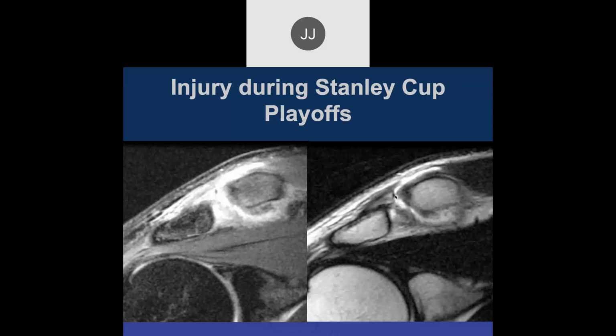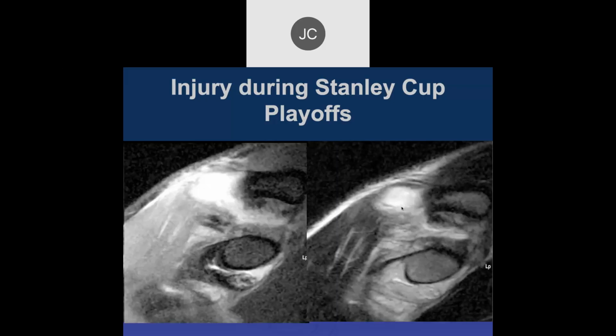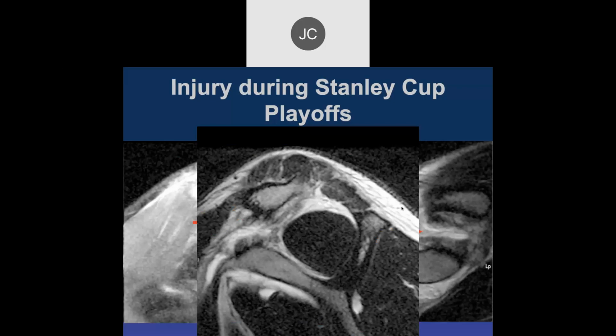So some edema of the acromioclavicular joint and then disruption of the ligament. Okay, so now what do you want to look at next? I would like to look at the coracoclavicular ligament, which, this is the coronal plane. Oh yeah, there's a transversely oriented tear through it, so separated. This would be another type 3. On the sagittal images, yeah, we see another tear. That's really good.